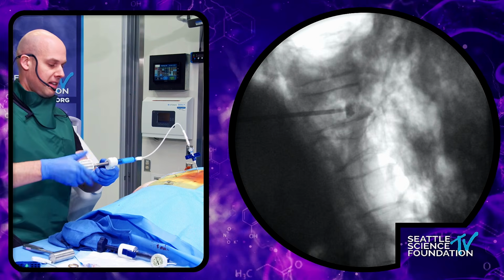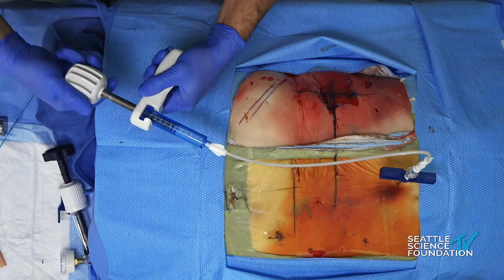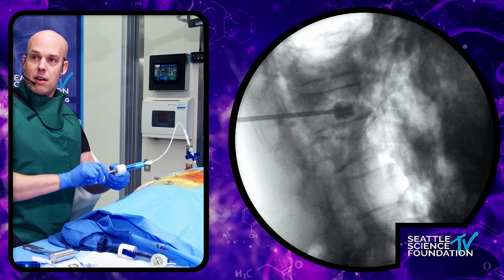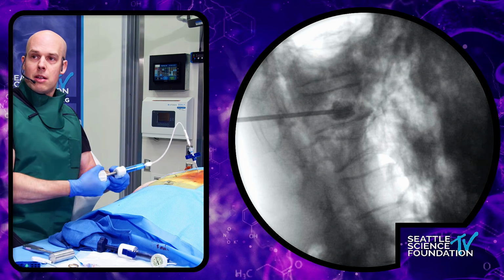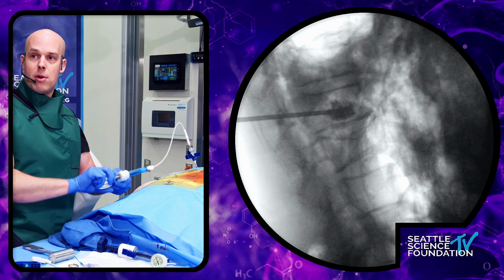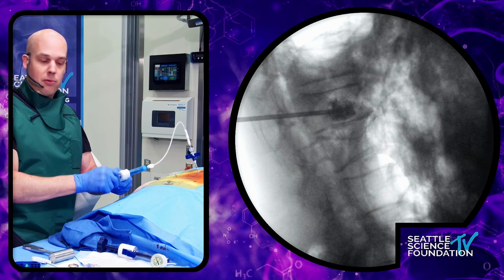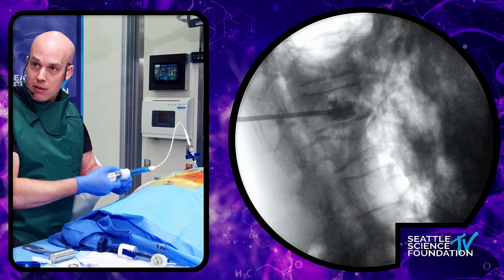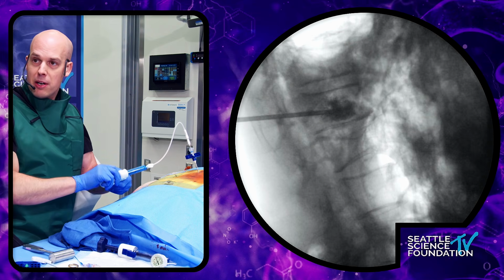The other delivery device that they have is a gun, and you can see through the cement. There is some heterogeneity, very nice. All right, so we're going to see a nice fill here throughout the vertebral body, and now normally in a live patient you would see a nice flow as well. So now you could see the vascular flow within the vertebral body.